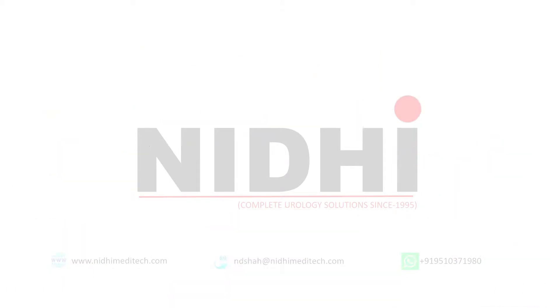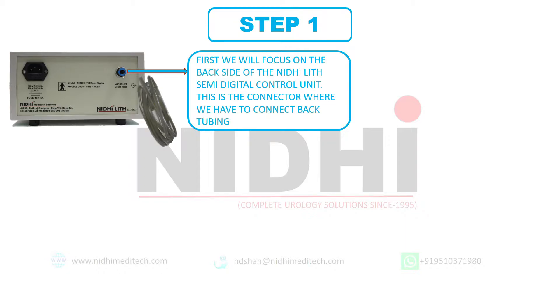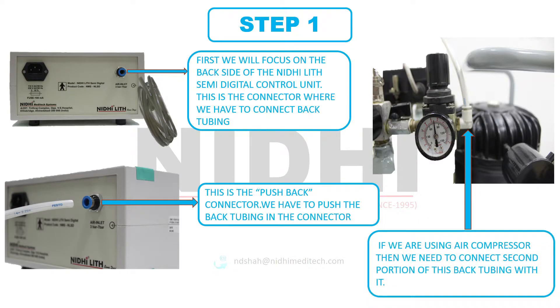We have an oxygen regulator and the mains cable in our kit. Let's start step one. First we will focus on the back side of the Nidilit Semi-Digital control unit. This is the connector where we have to connect the back tubing. Here we will use the tubing which is of high diameter — which is thick compared to the other one. Remember, this is the push-back connector; we have to push the back tubing into the connector. Now we have two alternatives for air supply: one is an air compressor, and the second is by using an oxygen cylinder. If we are using an air compressor, then we need to connect the second portion of the back tubing with it by gently pushing the tubing, as we can see in this image.